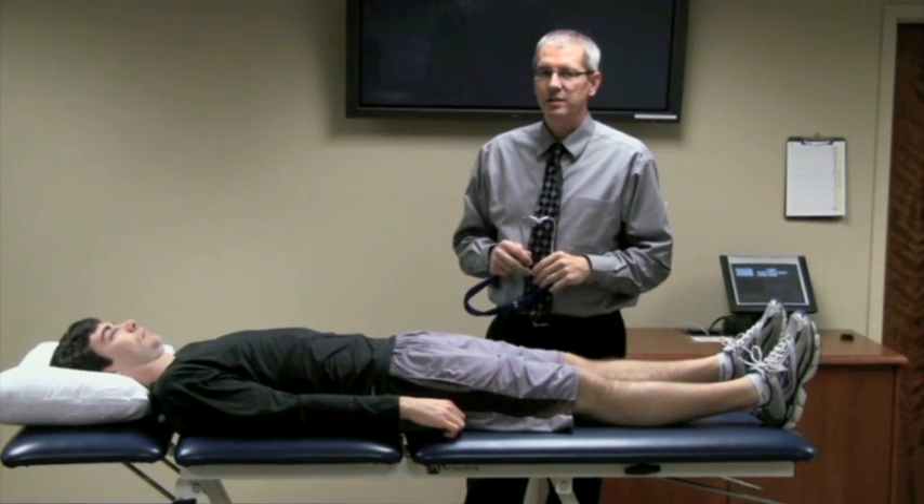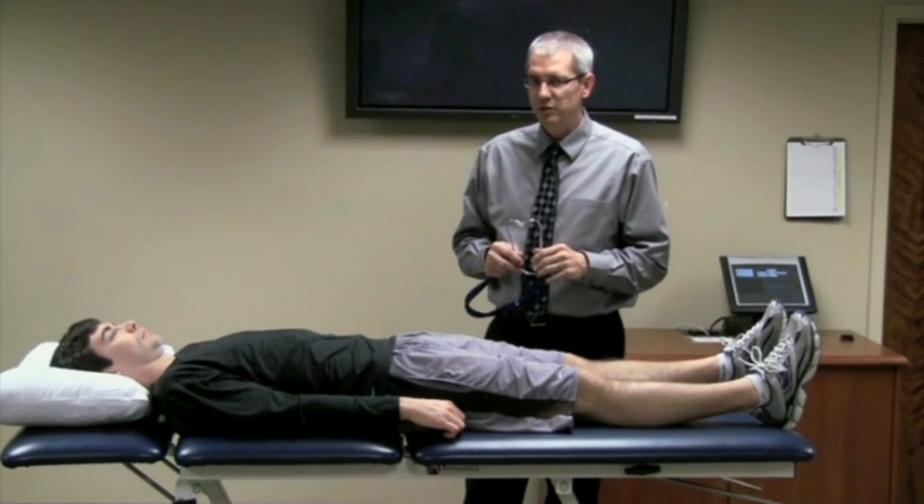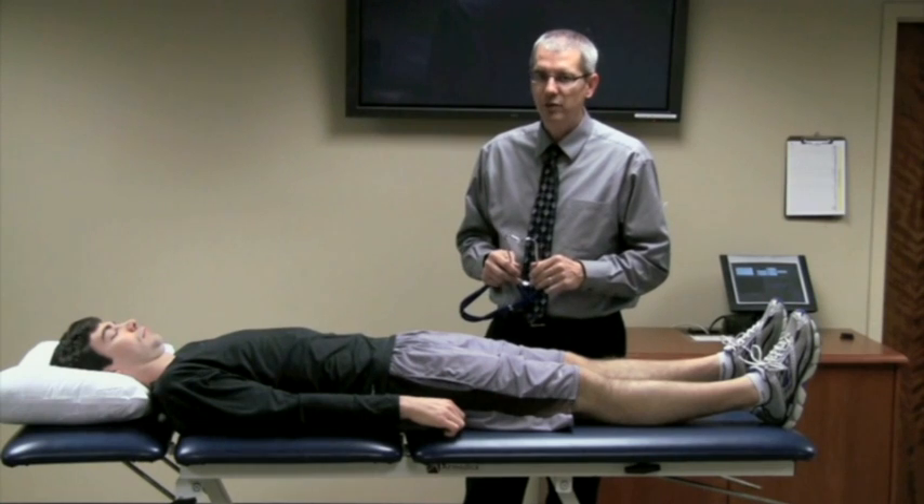The patella pubic percussion test is a good assessment for fractures of the femur. What you want to do with this is use the stethoscope and either tapping the patella or use a tuning fork on the patella.